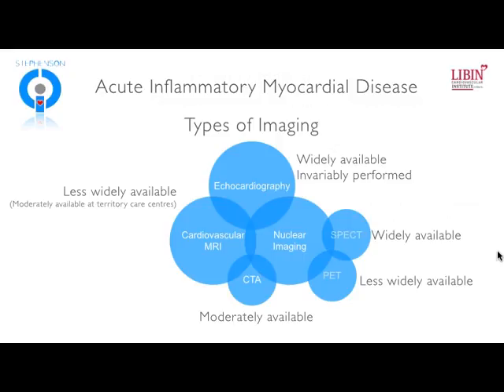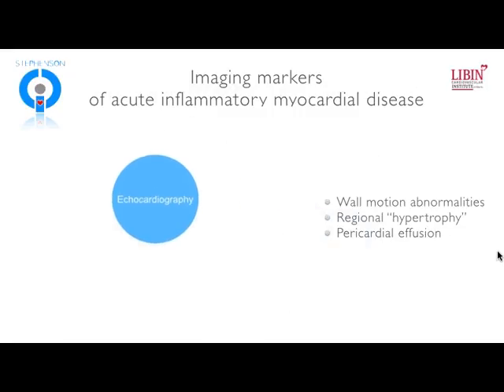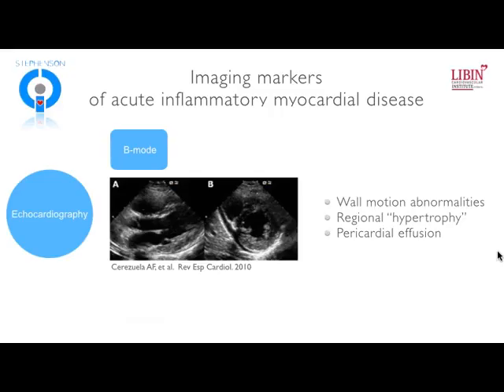examination performed. Nuclear imaging techniques, SPECT imaging is widely available, PET less so, but we're going to talk about some of the strengths and weaknesses of nuclear in this clinical setting. Now, CT is now moderately available and has some early potential roles, but is very much in the experimental or preclinical phase for evaluation of things like myocarditis. So that brings us to cardiovascular MRI, which, granted, is less widely available, but is increasing in availability internationally at tertiary care centers.